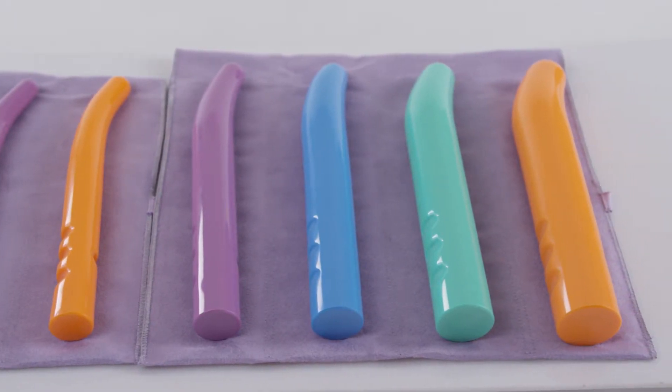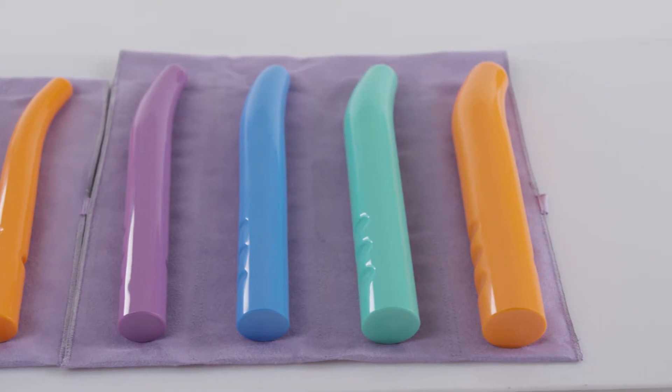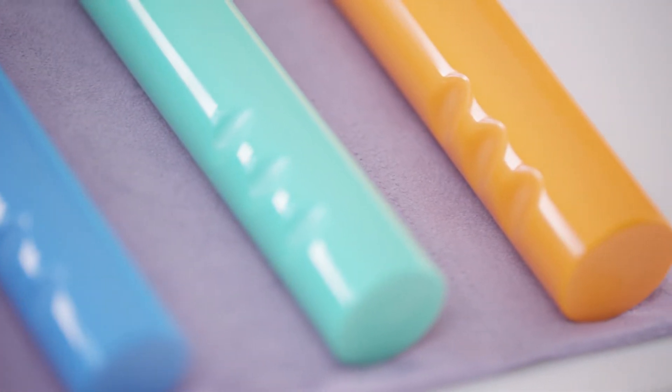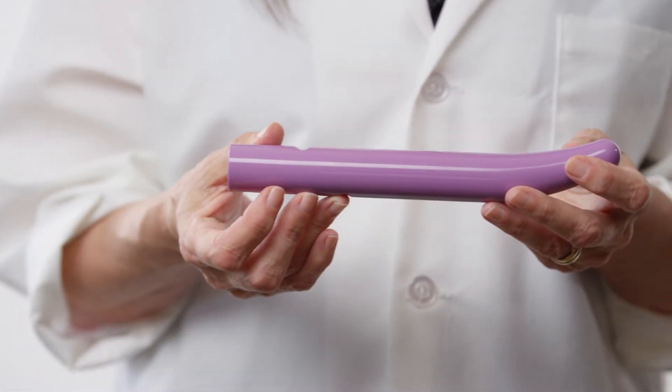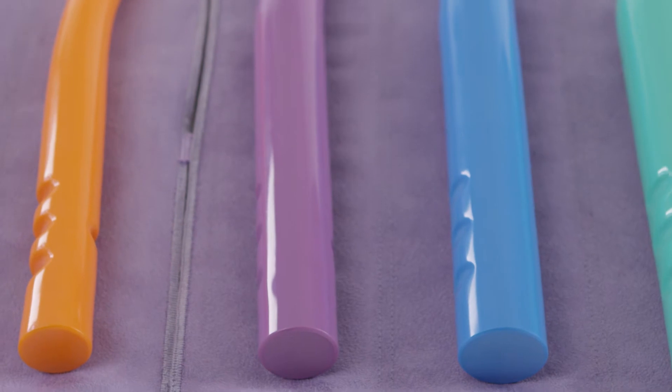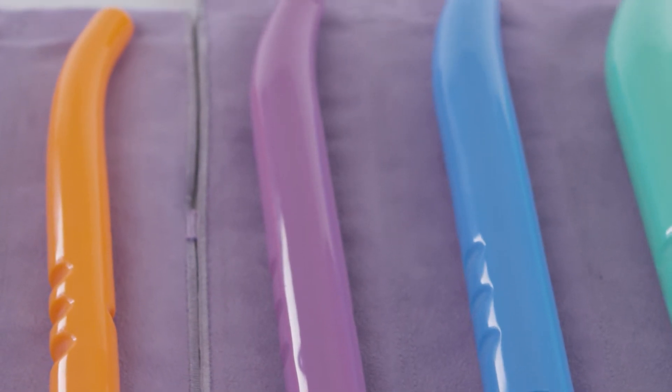The GRS dilators are available in six sizes. The feature unique to SolSource's GRS dilators is the curve, which better accommodates the pelvic capacity of the woman's body and allows for easier insertion into the vagina.